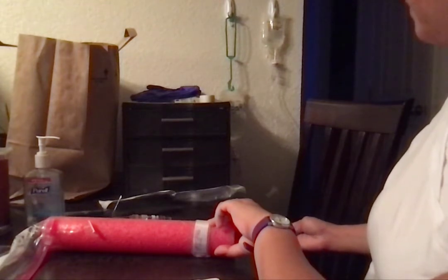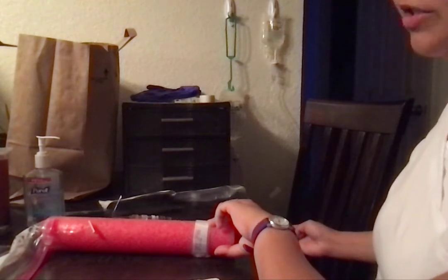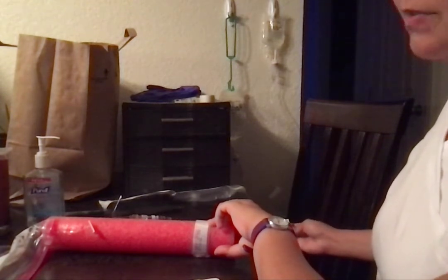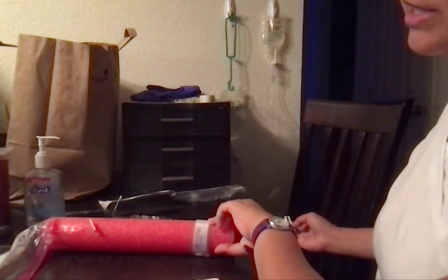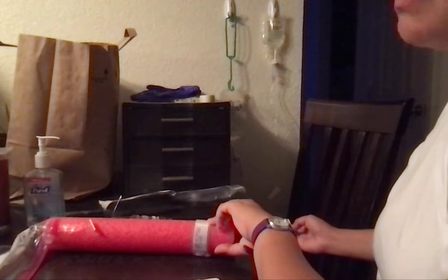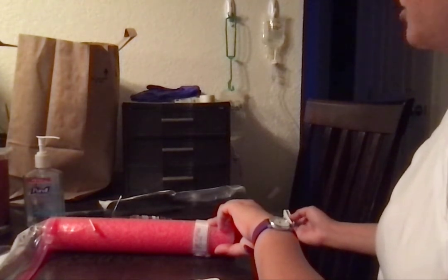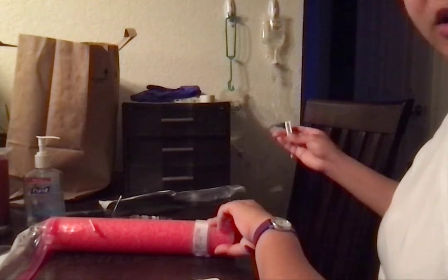Now, Millie, before I actually start administering this, I just want to make sure you understand that this medication is an antibiotic that your doctor ordered for you, and it's just to treat your urinary tract infection. Do you have any questions about that? No? Okay. Just wanted to double check with you before I start administering it. So now I'm going to start unrolling it.